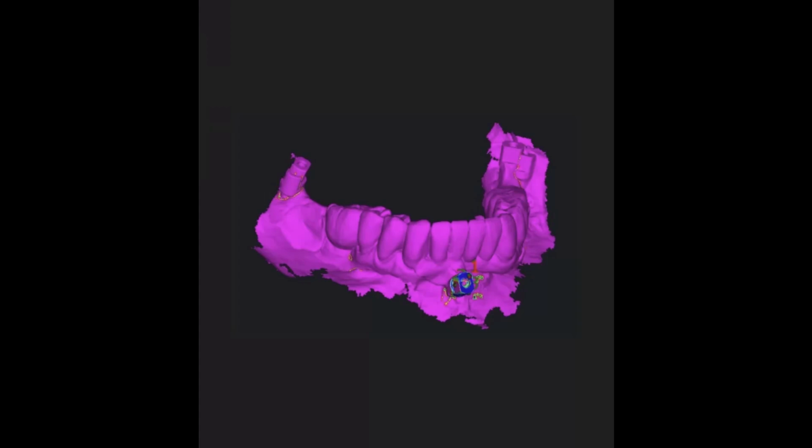I'm going to be talking about mandibular full arch and digital alignment. So this is all through something that I developed. If you're looking at YouTube right now, you can see an image on our screen. You'll see 3 fiducial markers, one in the anterior mandible. That's my technique, and you'll see it perfectly under alignment. And you'll see 2 other scans superimposed on this image with fiducials in the posterior.